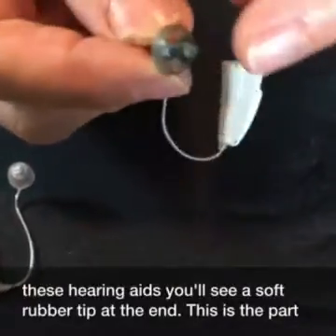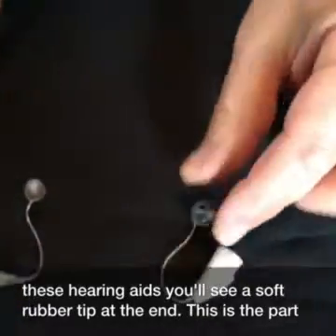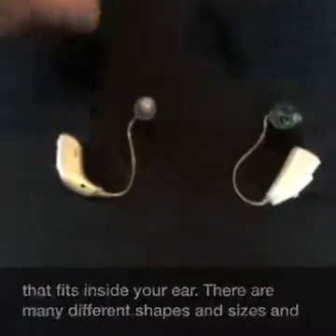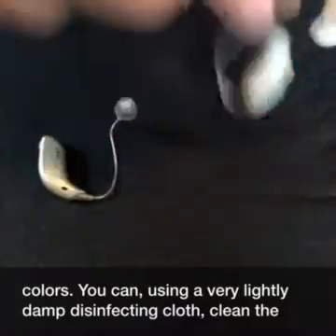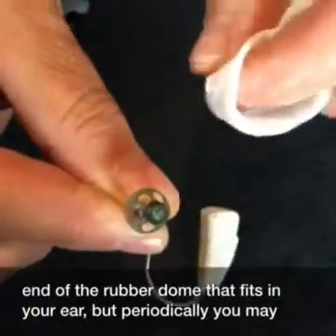For these hearing aids, you will see a soft rubber tip at the end. This is the part that fits inside your ear. There are many different shapes and sizes and colors. You can, using a very lightly damp disinfecting cloth, clean the end of the rubber dome that fits in your ear.